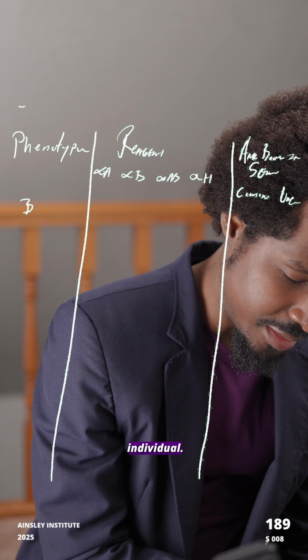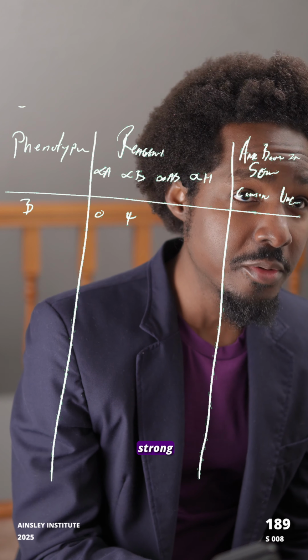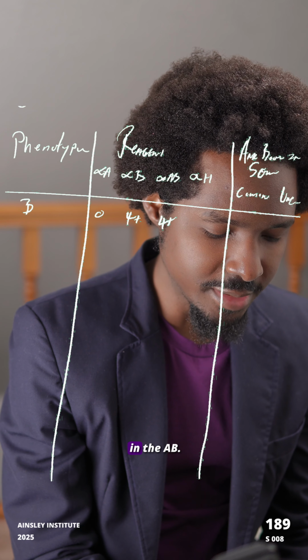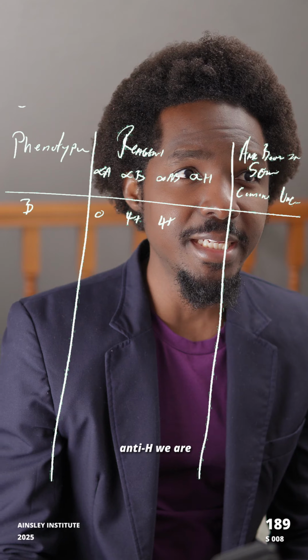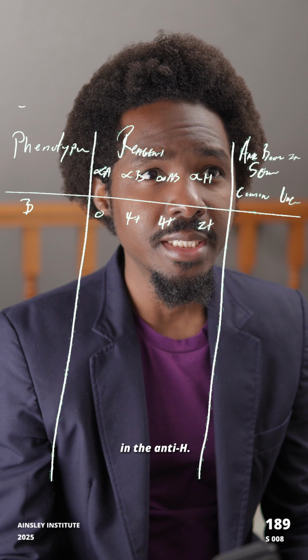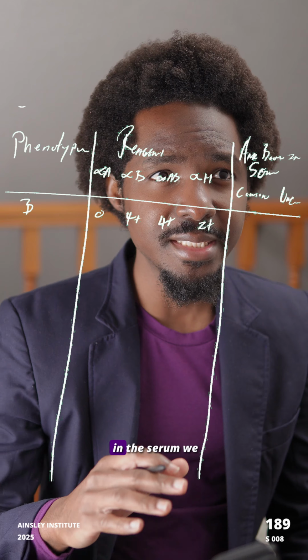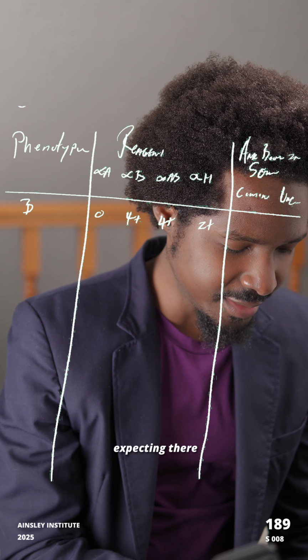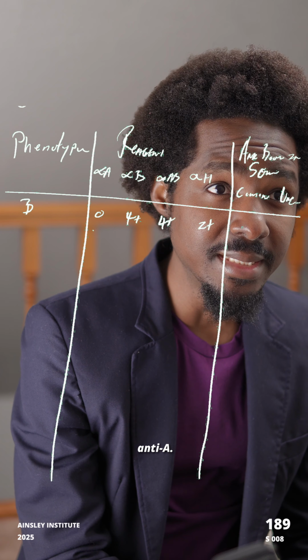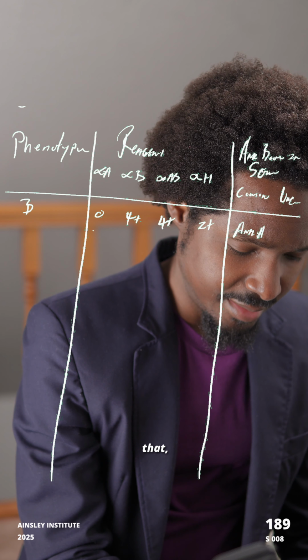Now let's start with the B, a regular B individual. We're expecting no reaction in the anti-A. We're expecting a 4+ reaction, or a strong reaction, in the anti-B, and a strong reaction in the anti-AB. For the anti-H, we're expecting about a 2+ reaction. When it comes to antibodies in the serum, we expect anti-A.